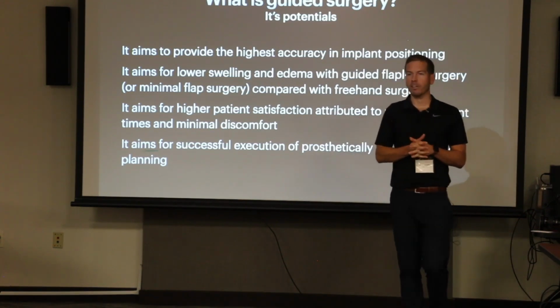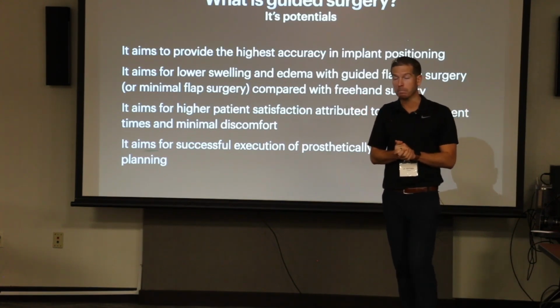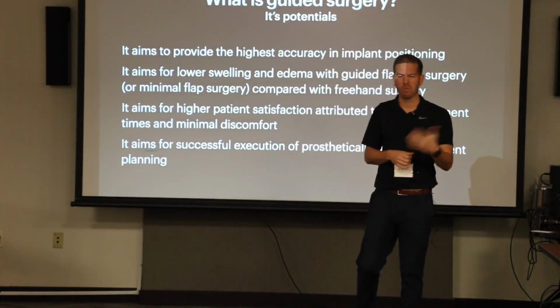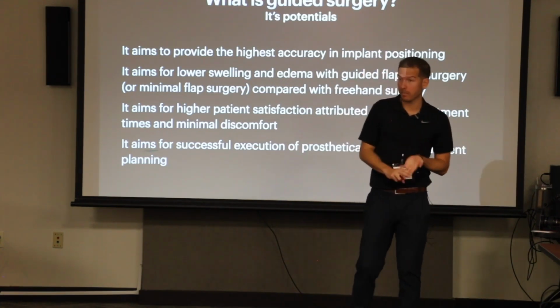And so if we can utilize guided surgery to be more laparoscopic in nature, that can be a benefit. So I use that term with a patient all the time, and if they're saying, why would I want guided surgery? Well, it's accurate, it's predictable, it's maybe less invasive.